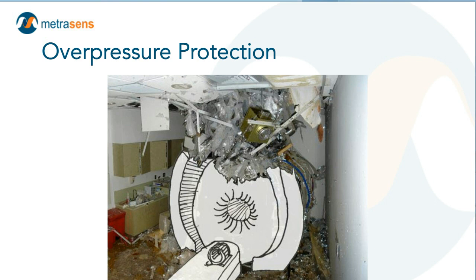And what we believe happened is water got in, and they actually had just filled this MRI, topped it off with 1,500 liters of liquid helium, or topped it off to close to 1,500 liters of liquid helium, and that froze the accumulated water in the pipe. When the magnet pressure increased and there was no mechanism by which it could relieve that pressure, it built and built and built inside the MRI scanner until it went kablooey.